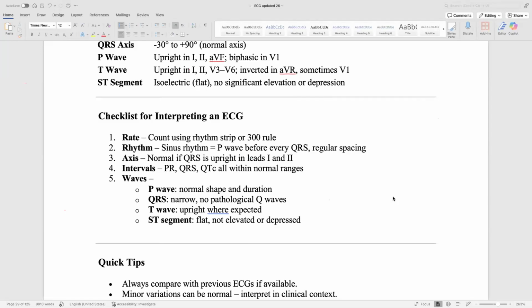Axis, I don't like it. Forget about it. It's the same as the question, what do you do for a living, in the OSCE exam. I hate this question. The axis has no that big significance. And in any lecture, when we are talking about the axis, they will leave everything and concentrate on the axis. Forget about the axis. Don't read it in the ECG. The information in the axis, you will find more clearly in other abnormalities.